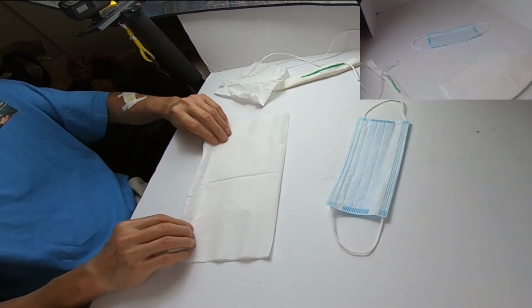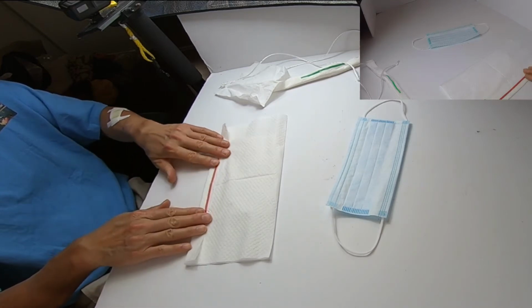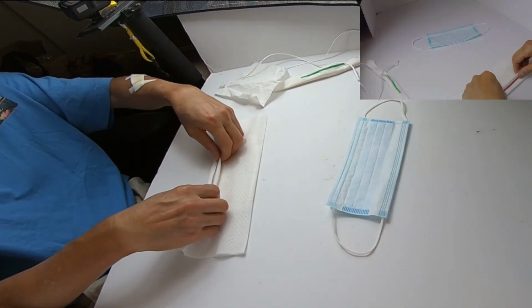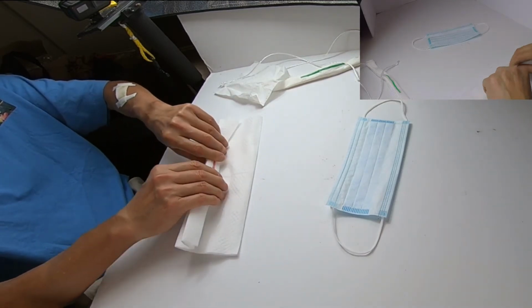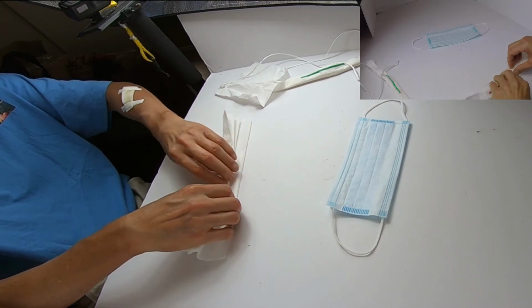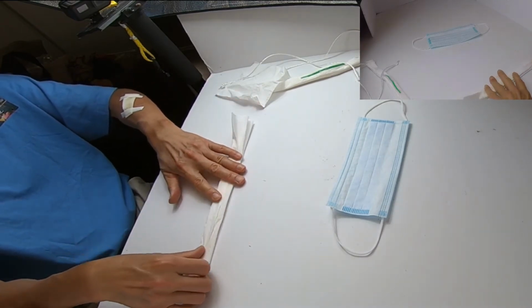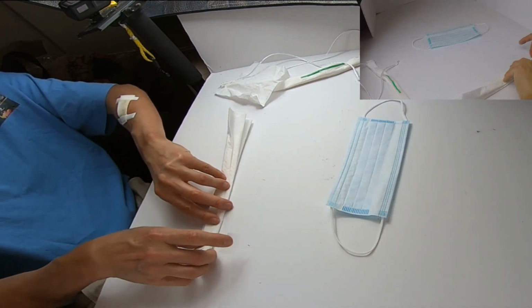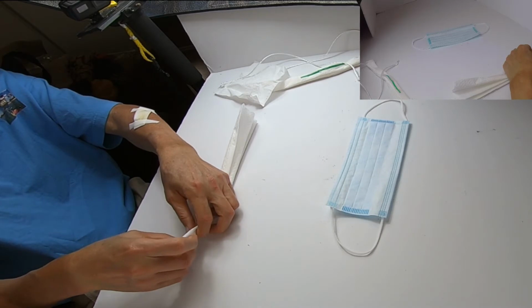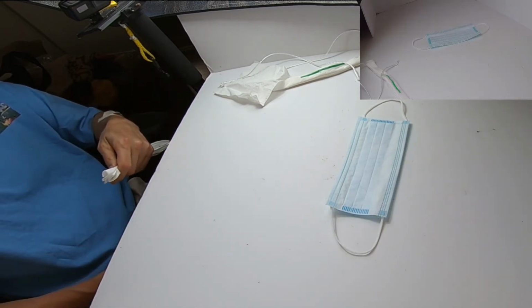The next phase is you turn the tissue or your napkin over and start pleating about a half inch. You start to fold, invert, fold. It's important that you start on the tie side of the mask and start folding until you reach the last bit. It doesn't really matter if it goes all the way down. And you tape the ends. And you go on the other side and tape the end as well.